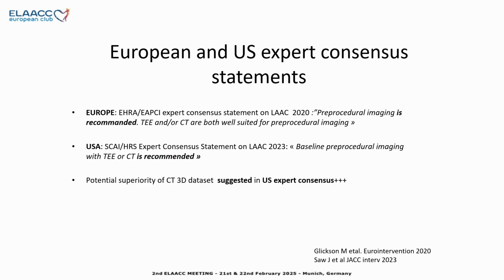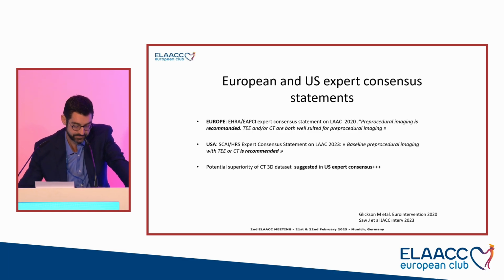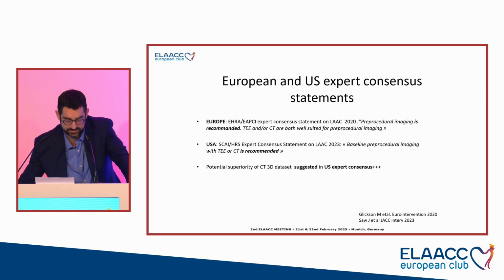Turning now to the European and US expert recommendations, you can read in both recommendations that pre-procedural imaging is recommended. We can perform either a CT or a TEE, but there is no specification on 3D TEE, at least in the European recommendation, because if you read carefully the American recommendation, you can read that there is a potential superiority of the 3D CT dataset, which is suggested in the dedicated section.